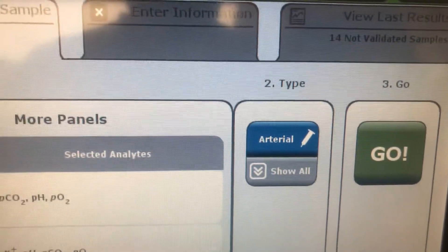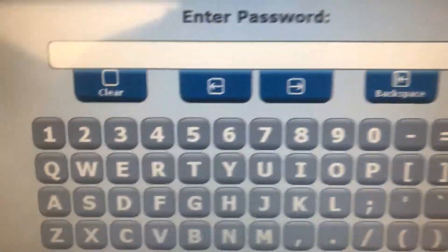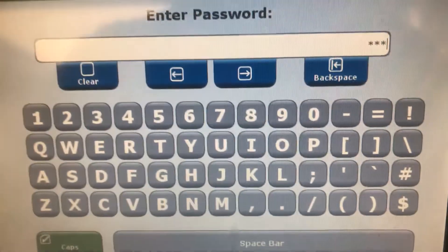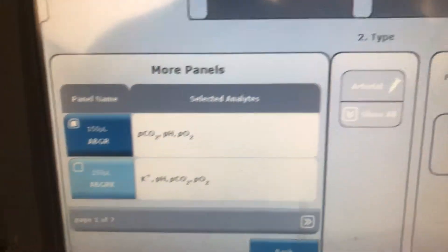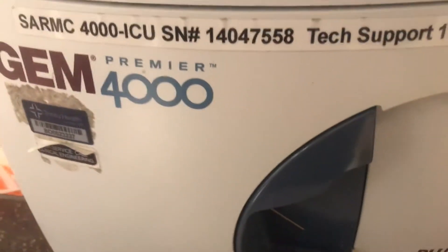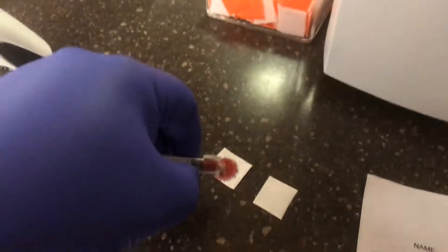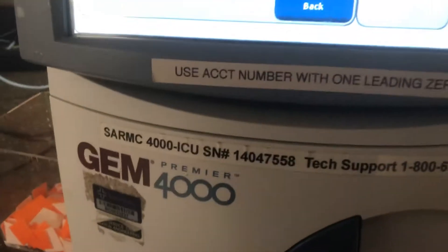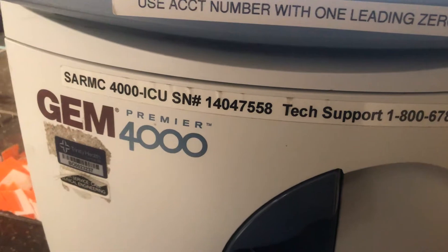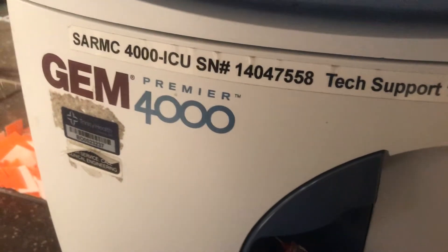We have to hit our go button. It's going to ask you to enter your password. Enter your password, press enter, and things start happening — a little stylus comes out. I'm going to take your sample and waste a drop of blood. They ask that you don't push it all the way down on the plunger.